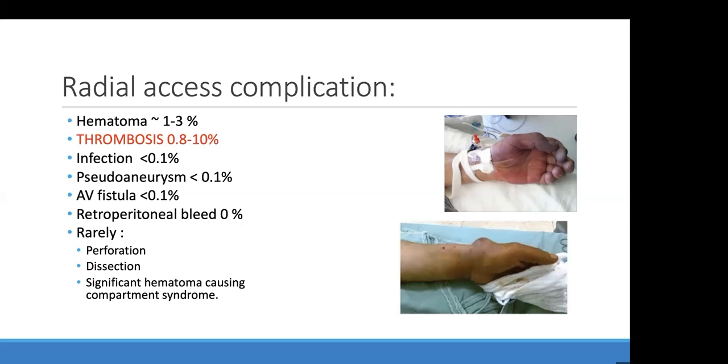Most of the sheaths here are 11 centimeters in length. For a perforation that is distal, I would advocate using the longer one, the 30, which has been shown in some studies to be good even for radial artery spasm because it delivers your equipment directly to the brachial artery, the distal tip. However, I don't see it available, at least in my lab in KTUH. We don't have the long radial sheath, but it's very effective and it should be available because it reduces the radial artery spasm and it can help because the distal end of the sheath is in the brachial artery rather than the radial.